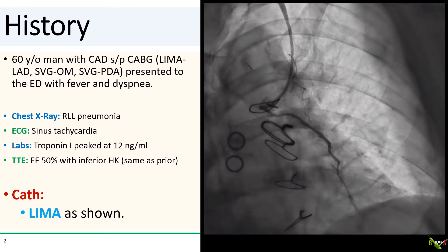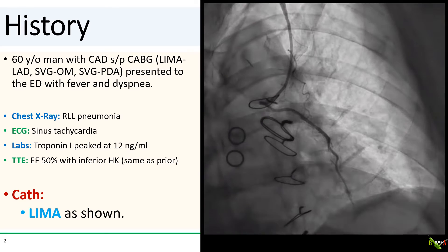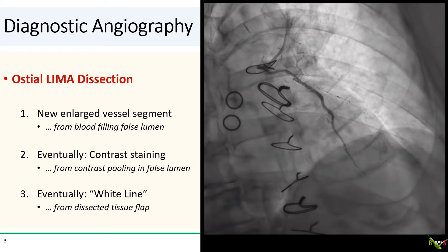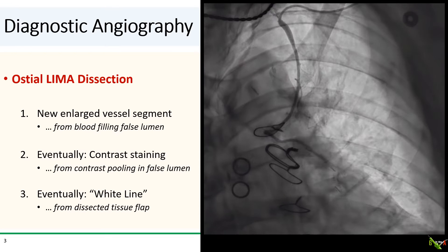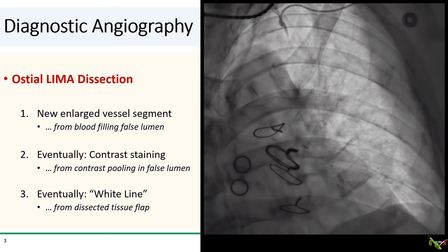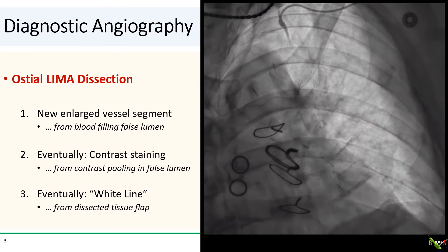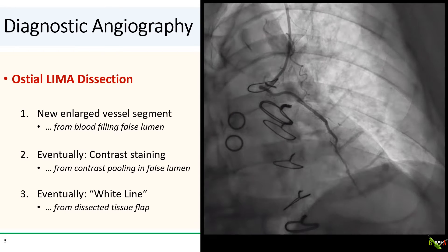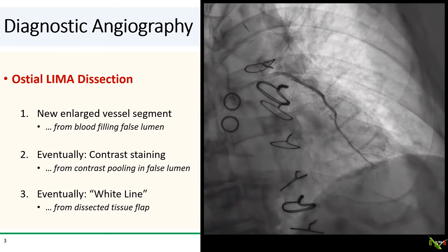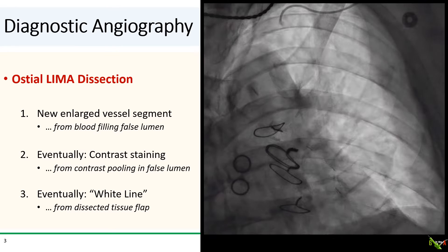You see here the first shot of the LIMA from the left radial approach. What we see here is a classic sign of the very start of a dissection that is important to recognize immediately — a suddenly enlarged vessel segment, propagating from the ostium of the LIMA down. This sudden enlargement is due to the formation of a false lumen, with blood and contrast filling the newly formed false lumen.